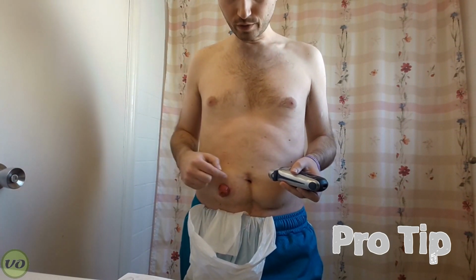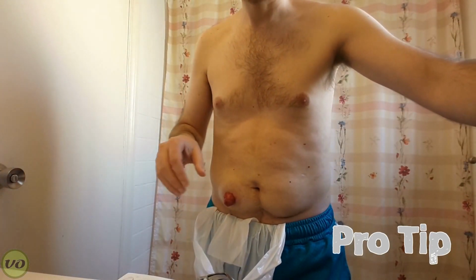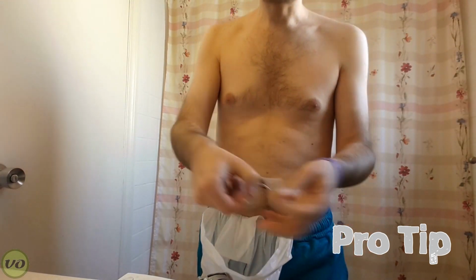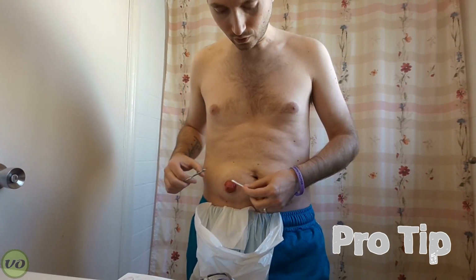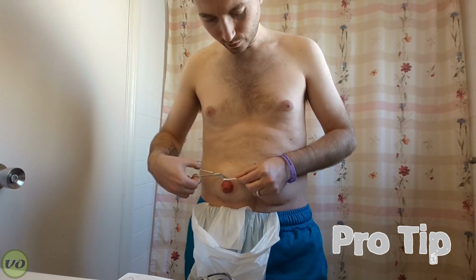Now, it's important not to get too close to your stoma. You don't want to cut it or cause it to bleed or anything like that. So if you're not comfortable going right around the edge, because sometimes hair does grow up against that, what I tend to do is I'll get a Q-tip, and then I'll use the Q-tip to push back some of the hair, and then I can easily trim it with the safety scissors that I've got. So if you've got anything like that in excess, you can just trim it, pull it away from your stoma and trim it, and just do that to your satisfaction.